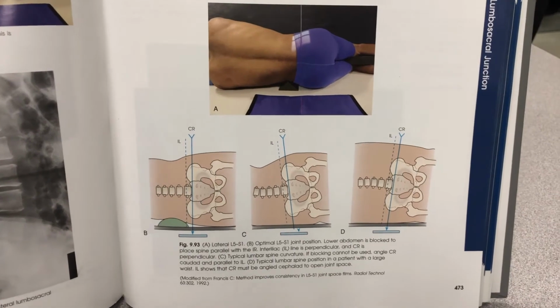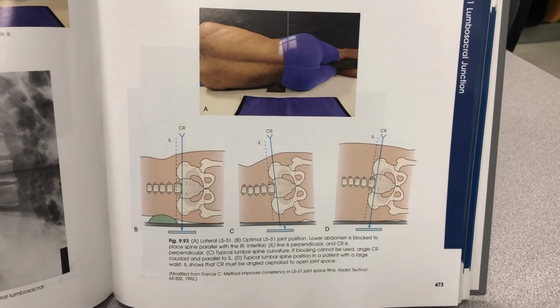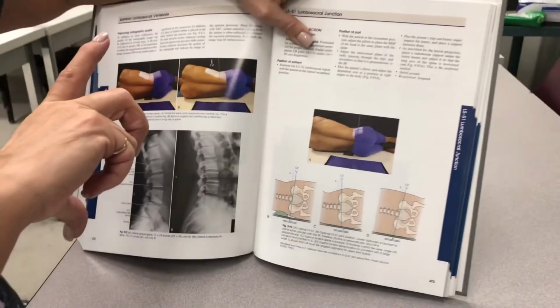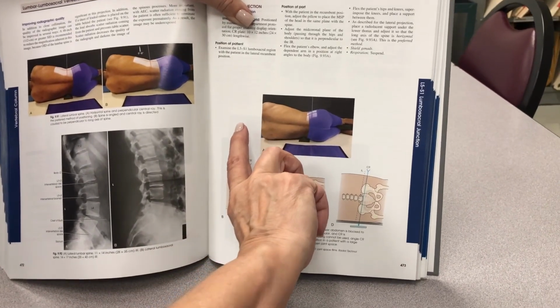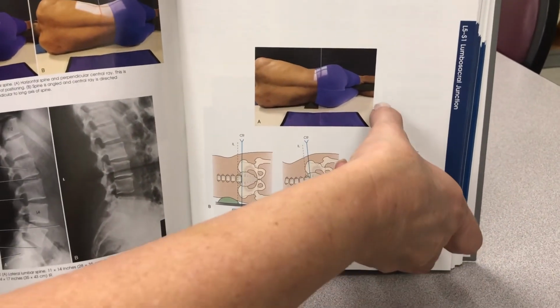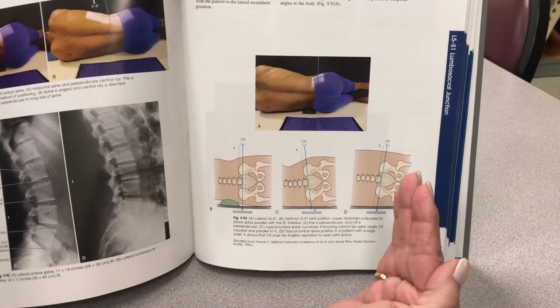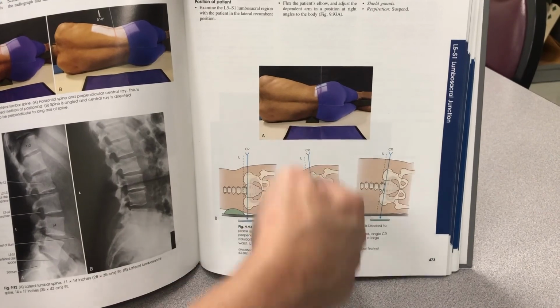If you have a very thin patient, or sometimes, pretty much on all women, you'll need at least a 5-degree caudal angulation, because their hips are broader. They tend to tilt in at the waist. But if you have a heavier patient or someone that has quite a bit of adipose tissue on either side, then you might need to angle slightly cephalad. But you determine that by looking at the interiliac line.